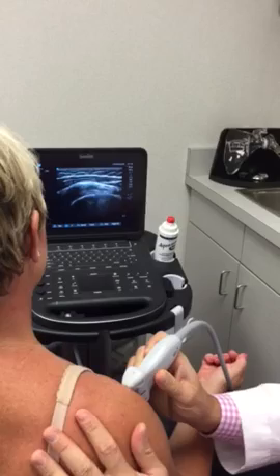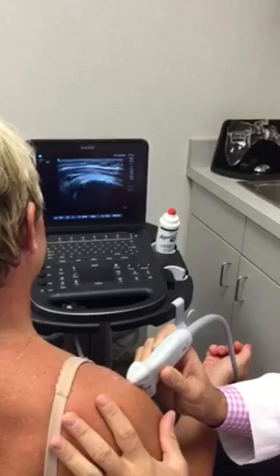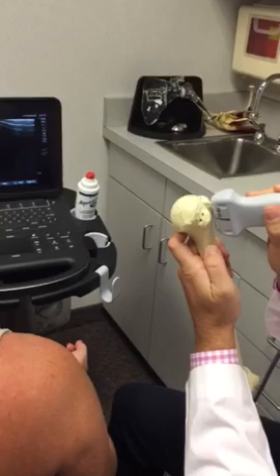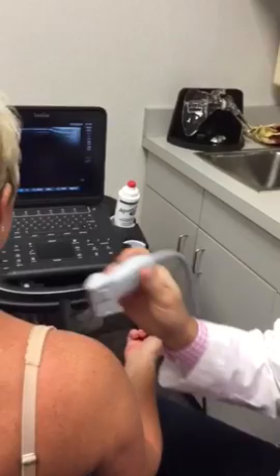This is actually how I inject my biceps tendon — I come here like this and the needle comes down. You can move just lateral with your probe and see the leading edge of the supraspinatus, though that's not the plane we typically examine. The easiest way to learn this is to find the bones first, and then you can find the soft tissues.